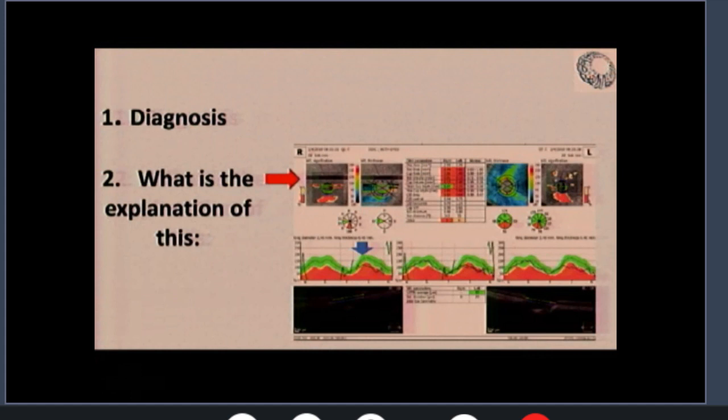So don't say this can be the red disease syndrome, where you see a sector that is in red and you say this can be glaucoma. Well, if you cannot compare and the values are not good, it's not useful. That is important to keep in mind. Tests that should help can sometimes be very confusing.